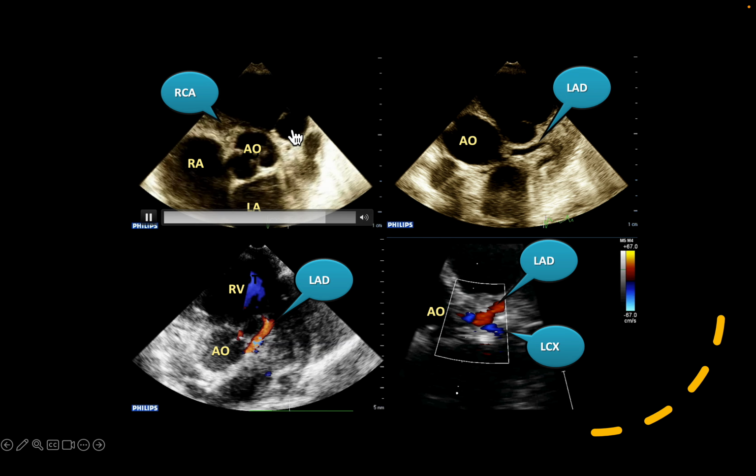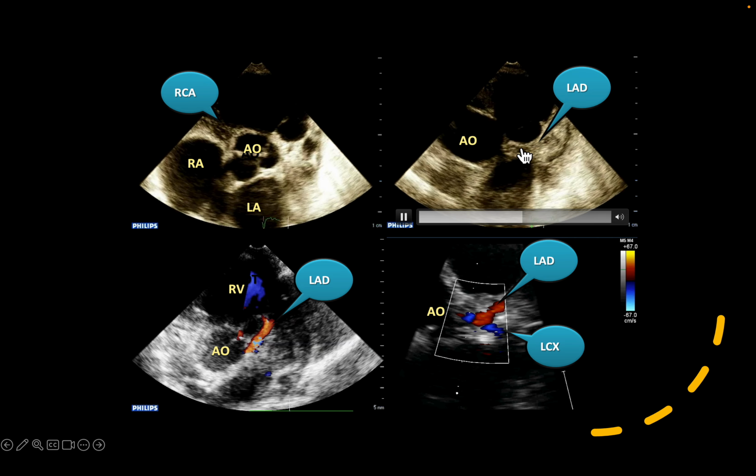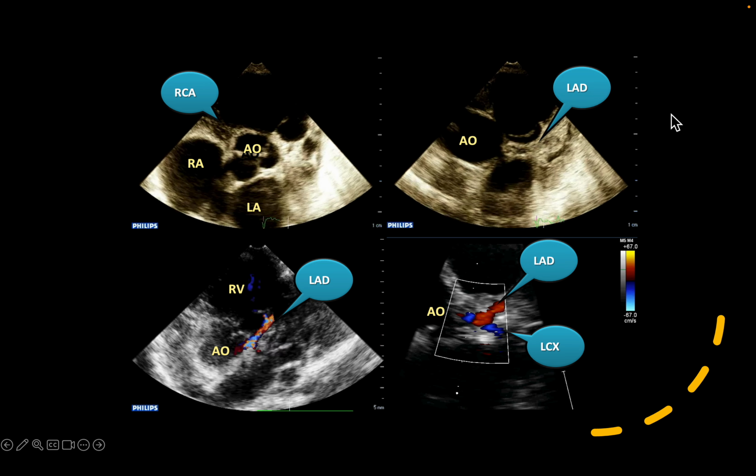This is the pulmonary valve, this is the pulmonary artery, right atrium, and in between the right ventricle and right atrium, where you have an AV groove, you have this tissue or fat. This is where you see the right coronary artery. When the left coronary artery is seen on the other side, this is a tissue between the RVOT and aorta and LA in the background.